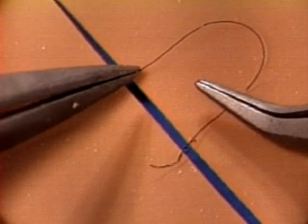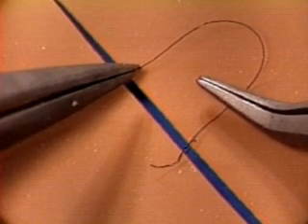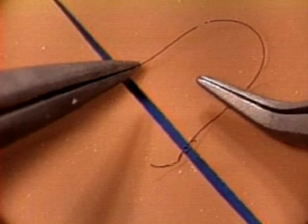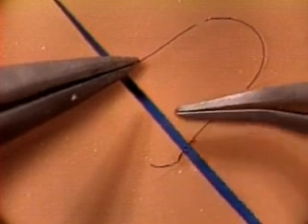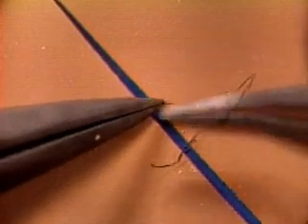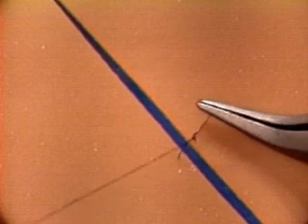Now for the second half knot. Since you didn't let go with your left hand forceps, you can go right into the second half knot without a break. Check that you can get the short end, change position if you need to, make the loop, pick up the short end, pull it through.